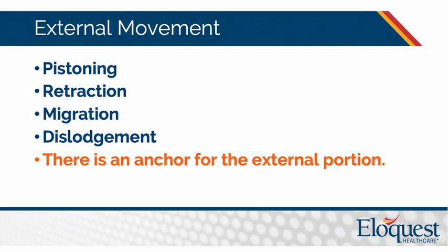Okay? So external movement, can we affect that? Well, yes we can. There's a number of options over there that'll tell you that it does that, okay? We want to eliminate pistoning, migration, dislodgement, retraction, all of those things. There is an anchor that will help you with that.